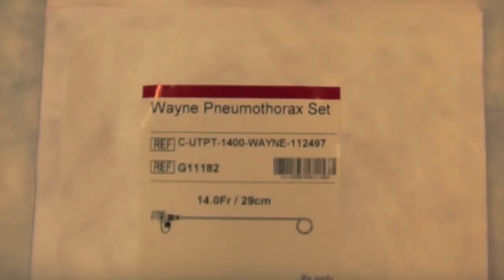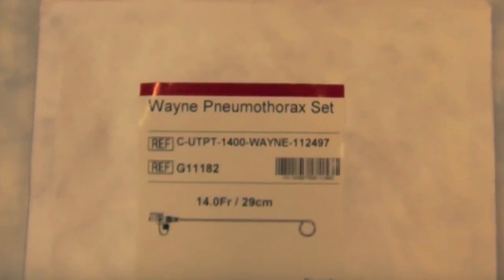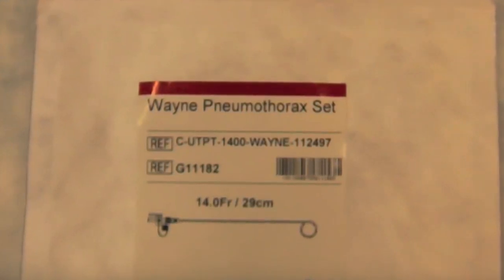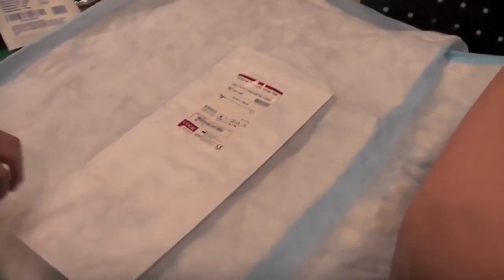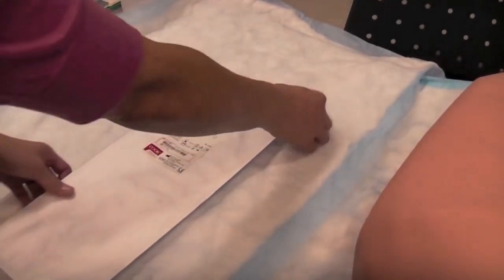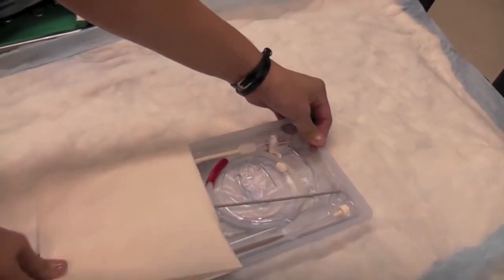The new pigtail catheter has several differences from the old one. It has a slightly larger diameter of 14 French, and it has a new part called the obturator, which is situated diagonally across the package when opened.